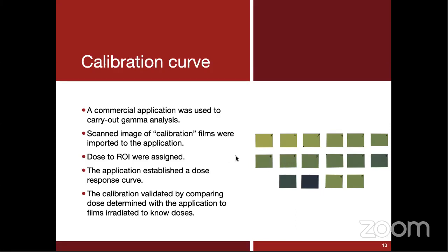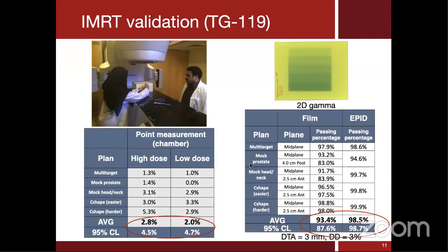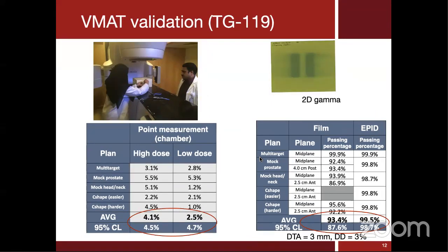So that's how we validate our calibration. We have used it for validation of TG119 and also for VMAT cases. But basically, that's our first application.